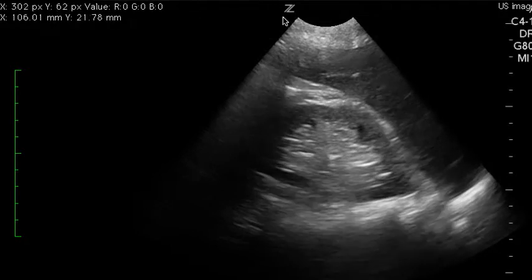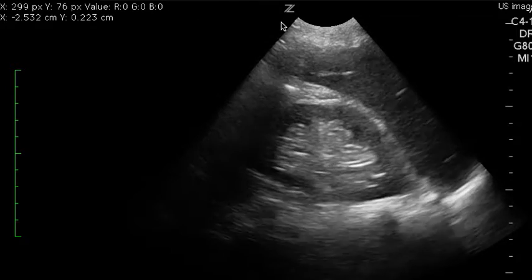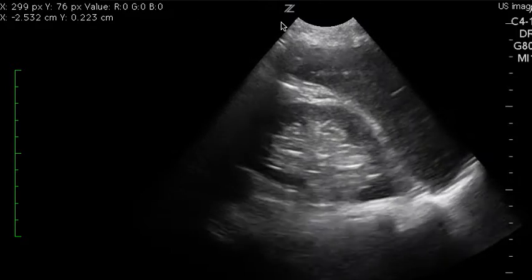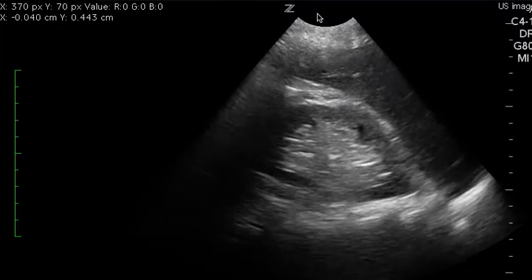One thing we want to focus on is that the probe is backwards. This is your Z. So right now the indicator is towards the patient's feet. I can tell that because your organ of interest is on the opposite side of the Z. You want it to be on the same side.